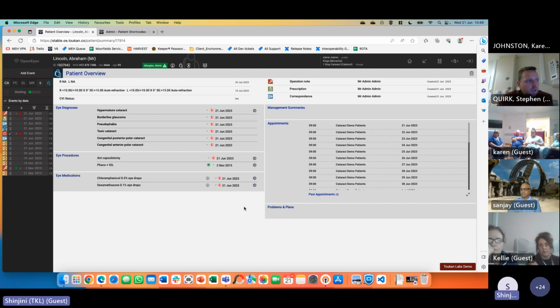What's the next question? One of them was from some of the team, whether Open Eyes will share with our ORMIS operating theatre system. That's part of the interoperability work we're doing with the project team. So we'll look at that separately.